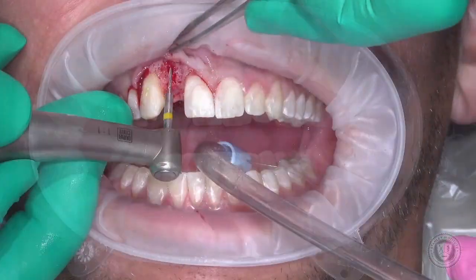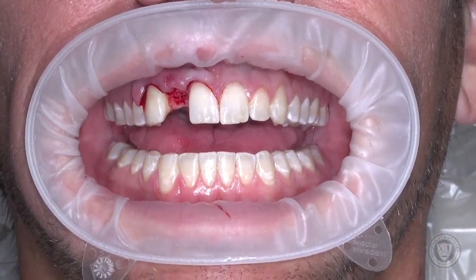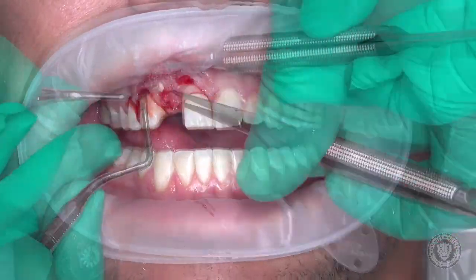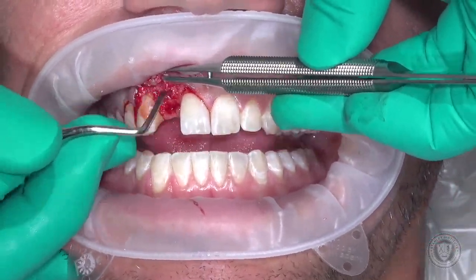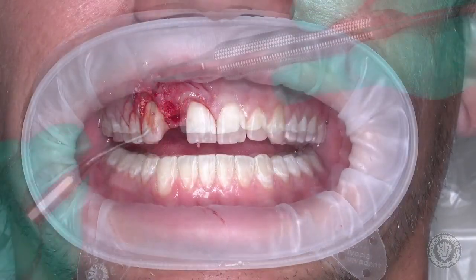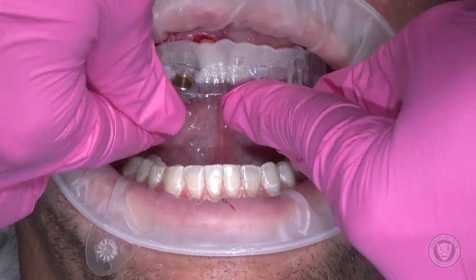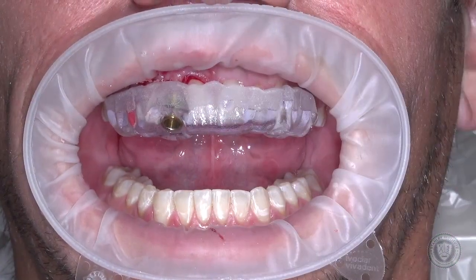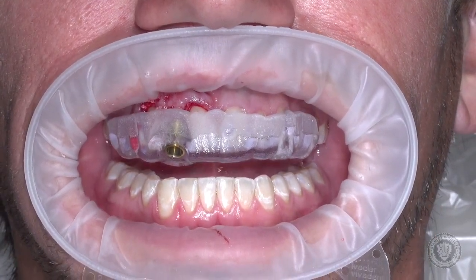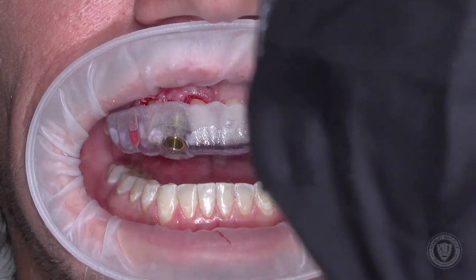It's a little big on the distal. At this point the guide goes back in. We go to our implant kit. The surgical guide was created on the 3Shape software, but the guide was printed by Vulcan Dental.